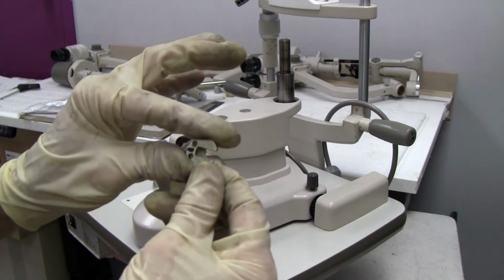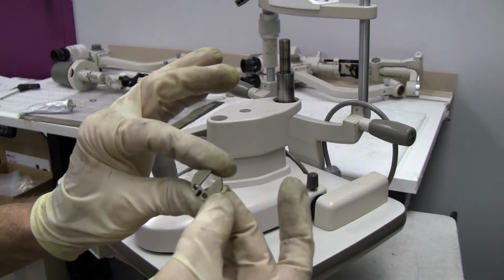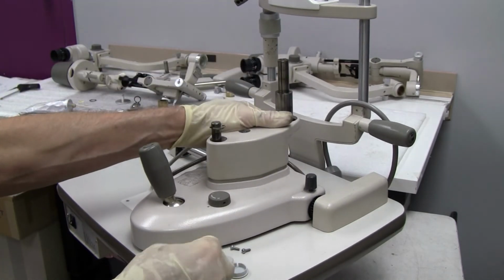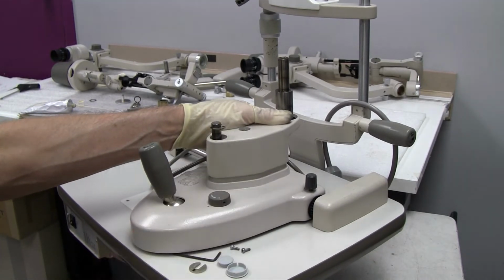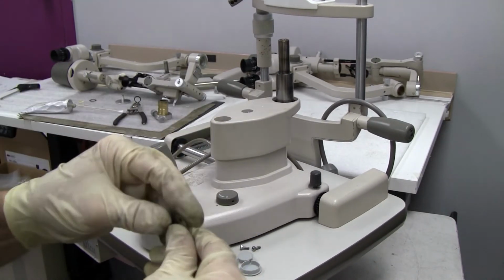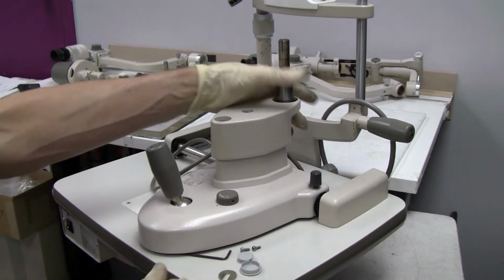stretched from use. So you might need to squeeze that gap a little bit so that it fits tight on your shaft. It needs to fit tight on there to minimize the movement. You have two screw holes and they line up with your Allens.